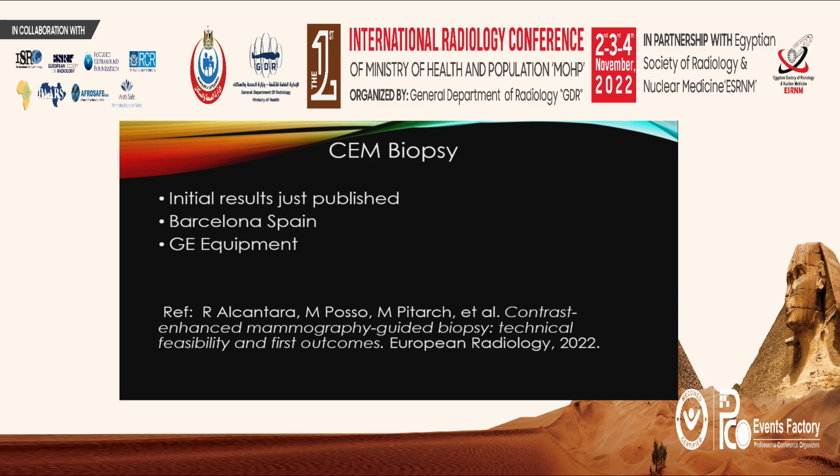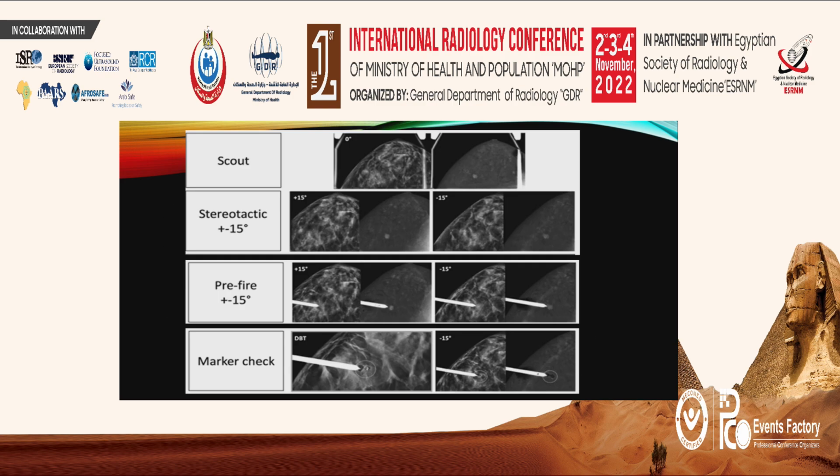Initial results were published from a group in Barcelona using GE equipment, and there's the reference. And here are some images from their paper, and as you can see, they include both the low energy image and the subtracted image, and they're the equivalent images to what we would do now in an upright stereo biopsy.